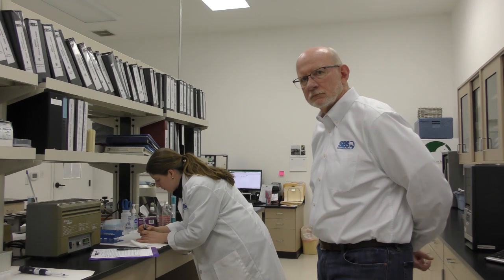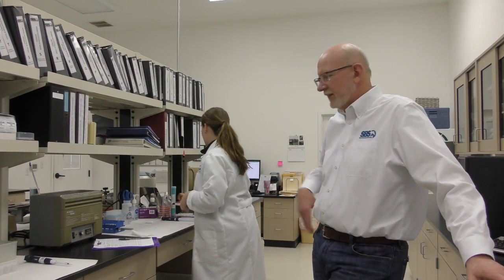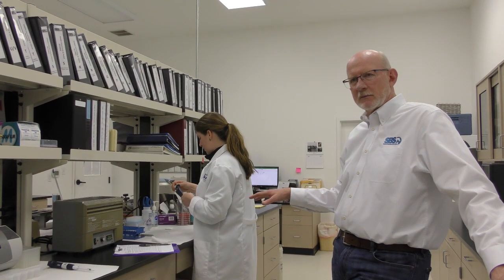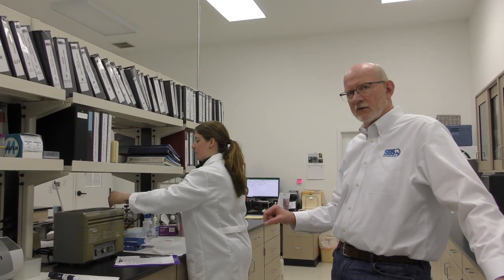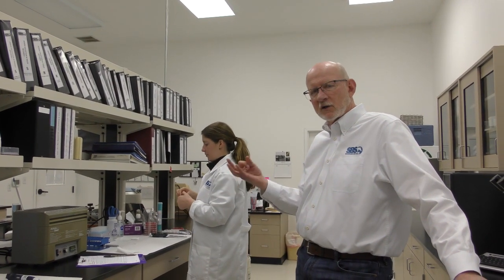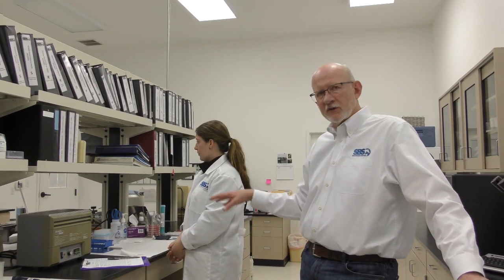And you do this process on every stallion you collect here for freezing, but also affiliate labs. Correct. Everything we do here for freezing, every single ejaculate, every batch of semen that we freeze, is evaluated this way. The affiliate labs in the SBS network send us straws for us to do quality control on the work that they do. So we're also evaluating bacteriology, sperm concentration, and motility on the semen that they freeze. Any semen frozen by an SBS affiliate network lab undergoes the same exact process.